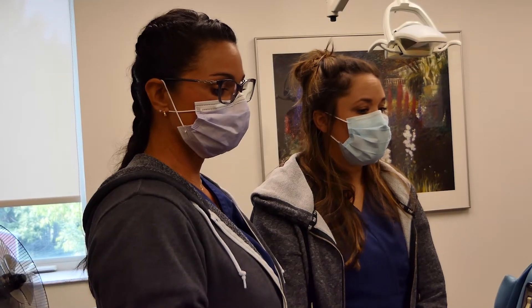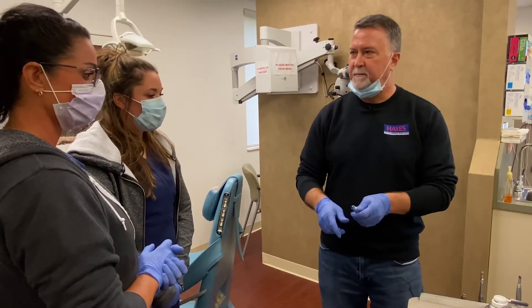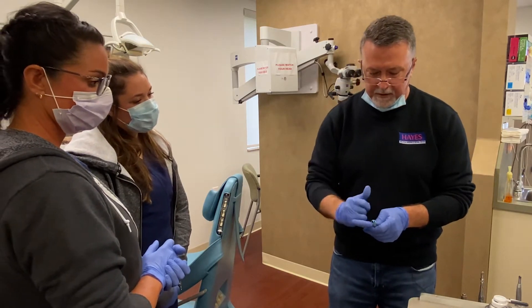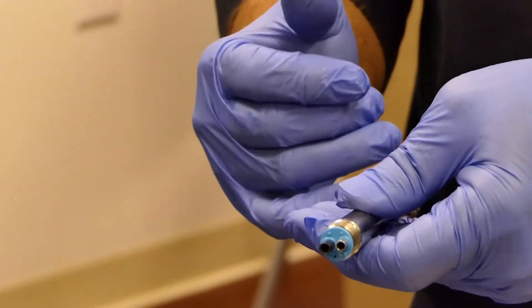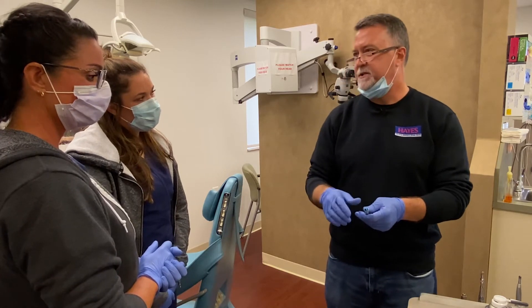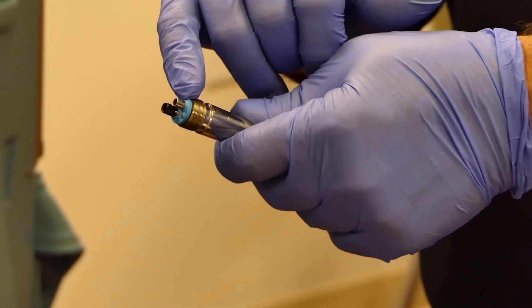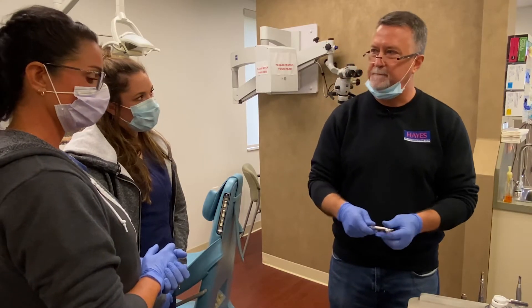We follow the same procedure with the surgical handpiece — identical steps. The only difference you'll notice is that on the back end there's just one tube for water, and when running it you see a steady stream of water rather than a mist. We're still lubricating into that same smaller of the two large holes, so identical steps are taken.